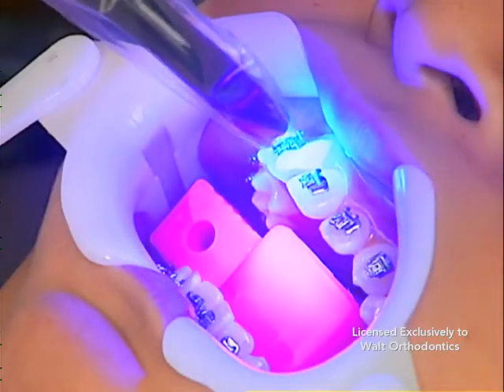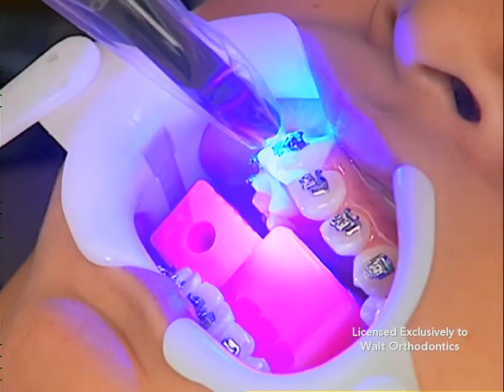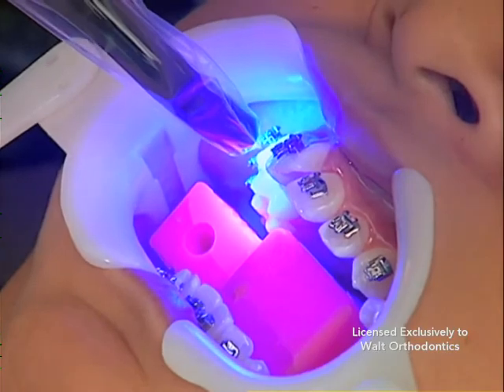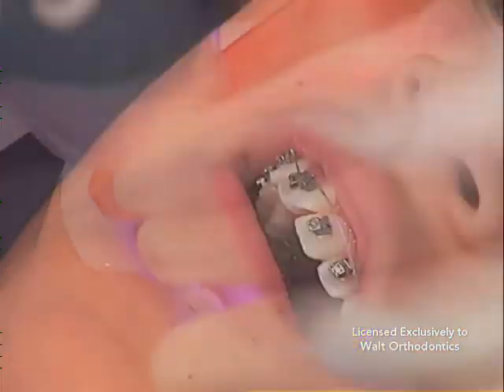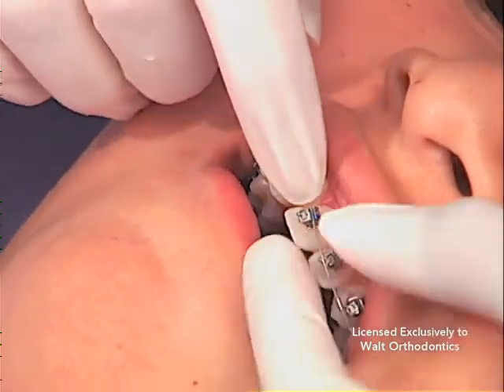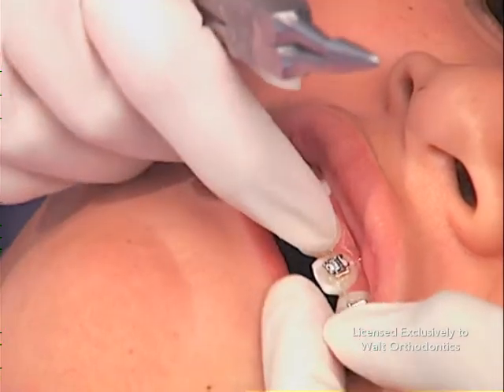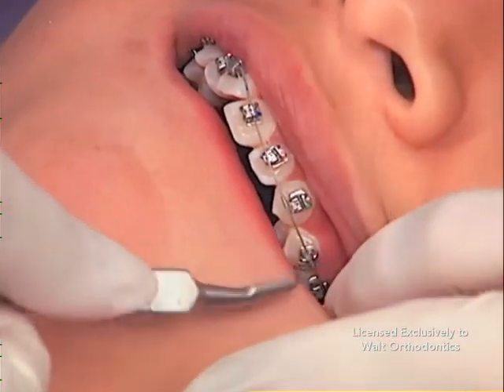Next, a high-powered but safe curing light is utilized to activate and harden the adhesive to secure the bracket to the teeth. Some bracket types are pre-coated with the bonding agent already in place. Lastly, an arch wire is placed in the brackets and secured. Today's arch wires are made of special metal material that creates force to move the brackets as the wire tries to achieve a perfect arch.